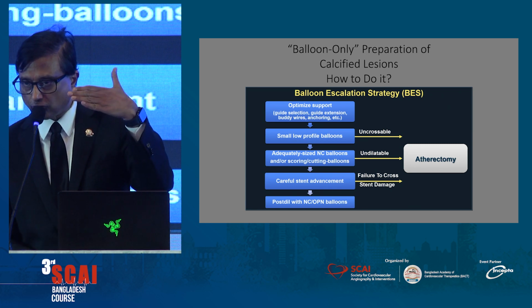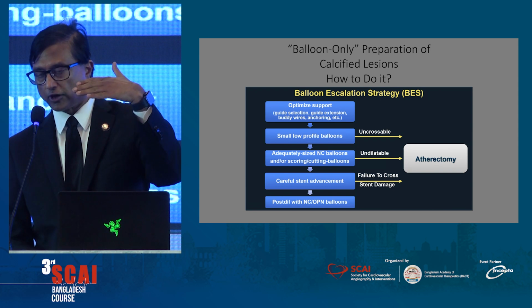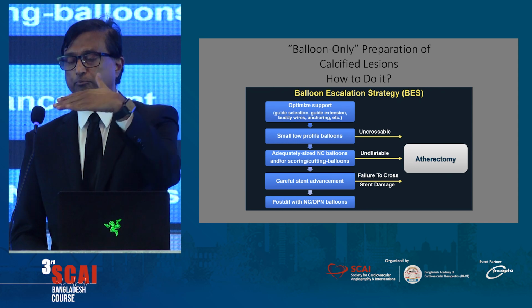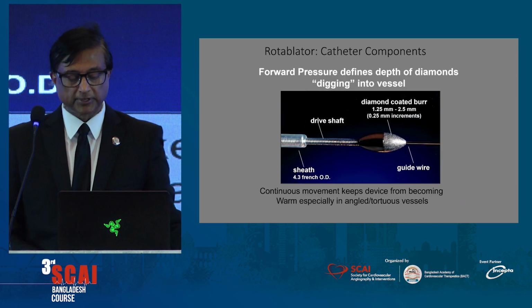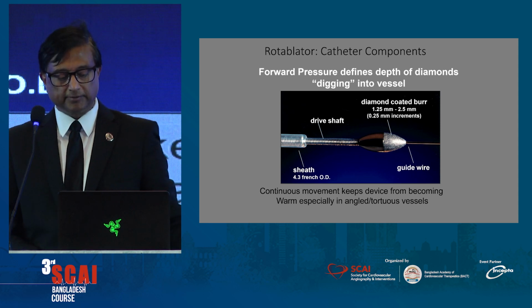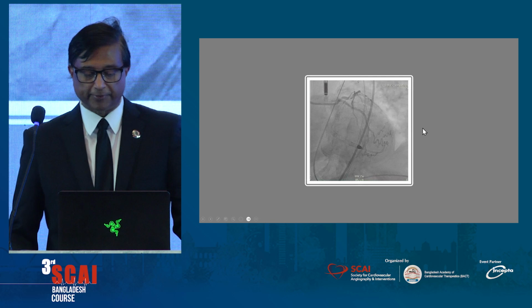And if the balloon does not cross, you can also do what I call, not dog boning, the wood pecking. So you can push the balloon and then give the shockwave and then advance and then do shockwave. But in a long lesion, I think it may not be that good in terms of getting the optimal preparation.